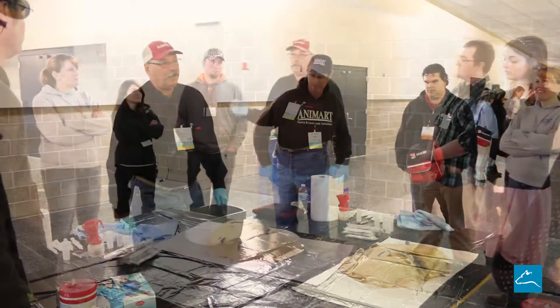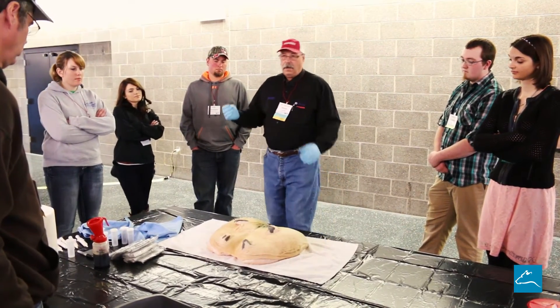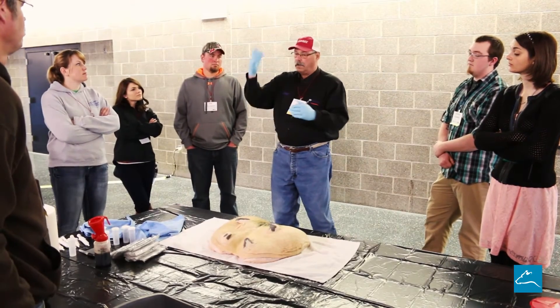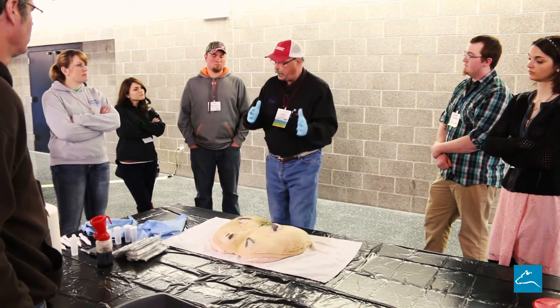What we're going to do, prior to that attachment, is — when we get to the point where it's strip, wipe, attach — we're going to strip the cow out, we're going to dip her, we're going to wipe that teat, and then that's where we go in.